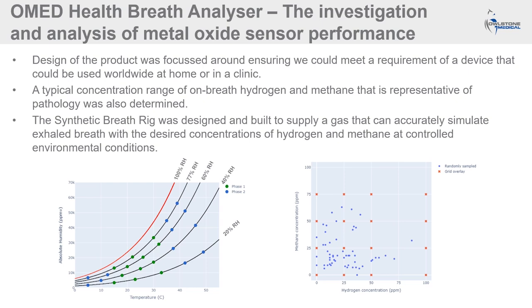This is because our initial focus on the training data collection was on regions where we would expect this device to be most likely used, i.e. in an indoor home or office environment. Phase 2 expands upon this to further detail environments representative of outdoor environments in both sunnier and colder climates.